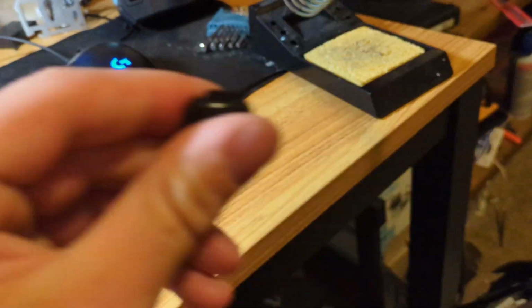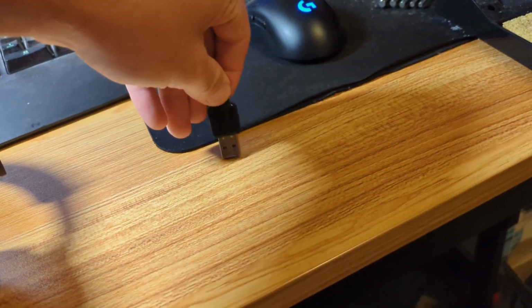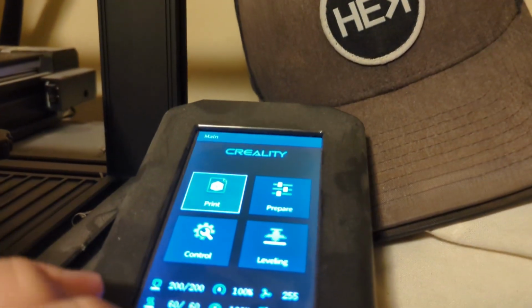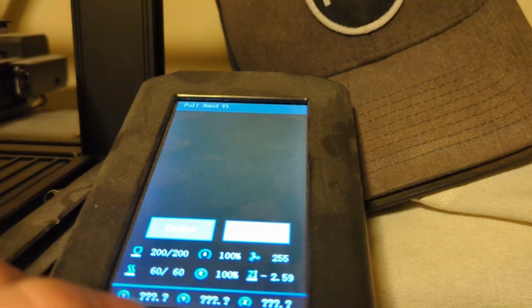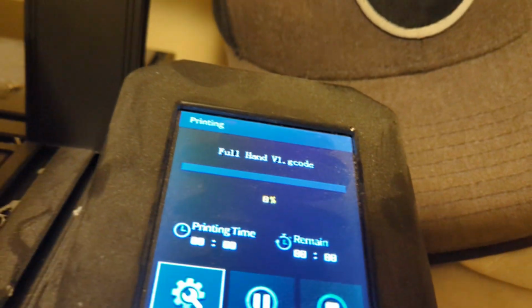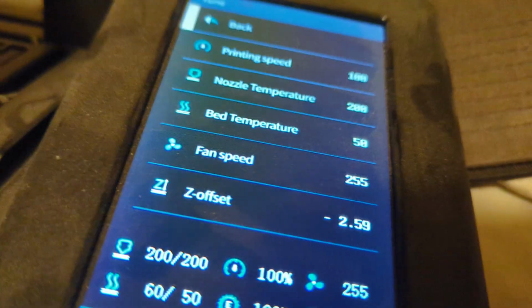That's another project. We can talk about that later. But grab the SD card reader. I've exported the print to it, and go ahead and pop that into the printer. It's got G-code on it. That's the code the printer reads. Makes it do stuff. So we go ahead and print the full hand. This printer is nice. It shows a little preview, which is a lifesaver at times. Now we hit start, and just hope that it all goes good.